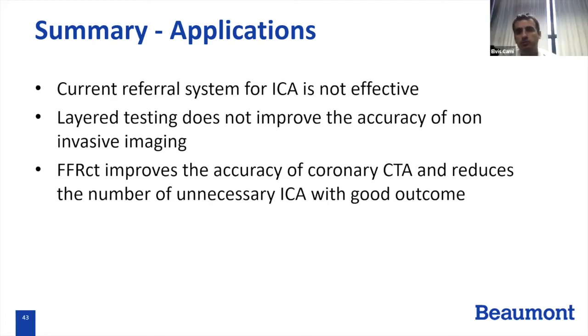And what percentage of the patients that you're scanning are triple rule outs, and what percent are straightforward coronary CT in terms of the orders at your hospital? Probably about 15% are triple rule outs, maybe 15 to 20%. For the most part, the triple rule outs are from the ER, but sometimes there are outpatient triple rule outs too. Oh, really? That would not be something I would guess.